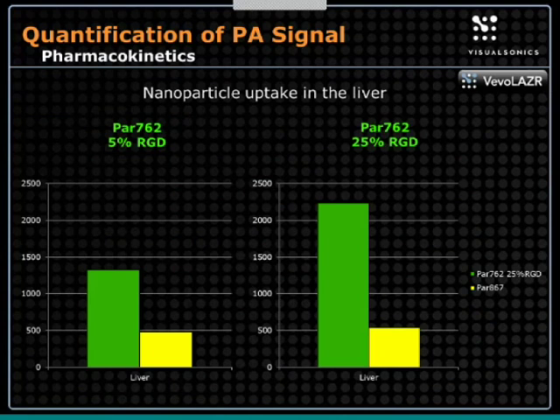A lot of people are using microscopy to do that kind of thing just because obviously you get your cellular resolution and you can see, are the particles sticking on the surface of the cell? Are they going inside the cell? Something that you won't be able to do with, despite our high resolution, it's not cellular resolution. You wouldn't be able to do that.